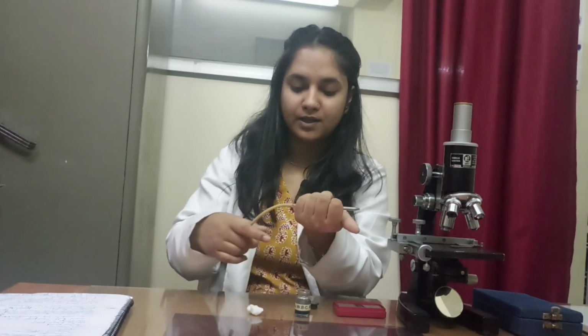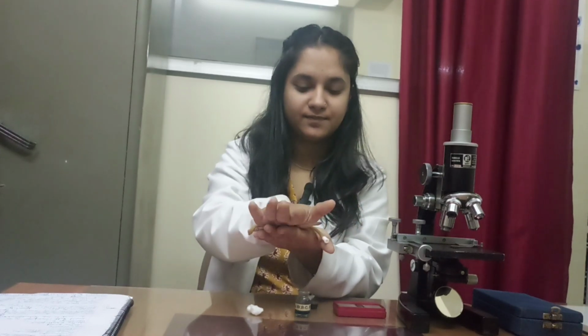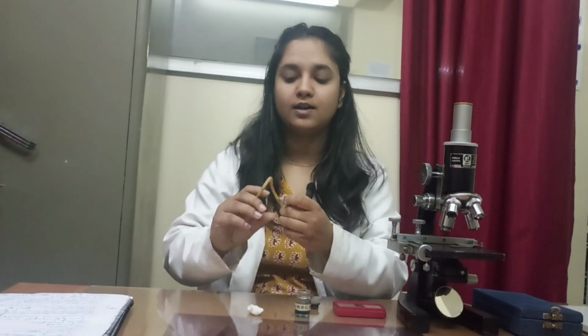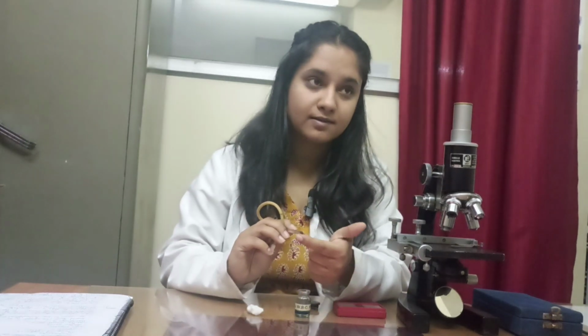We put this pipette in our palms and mix it like this. After mixing the blood, we should discard 1 drop of solution from this stem part.